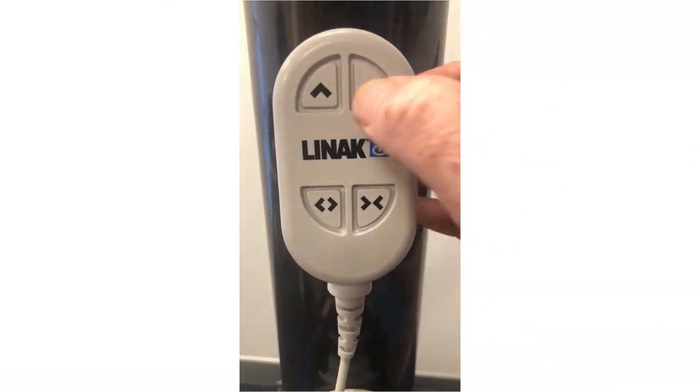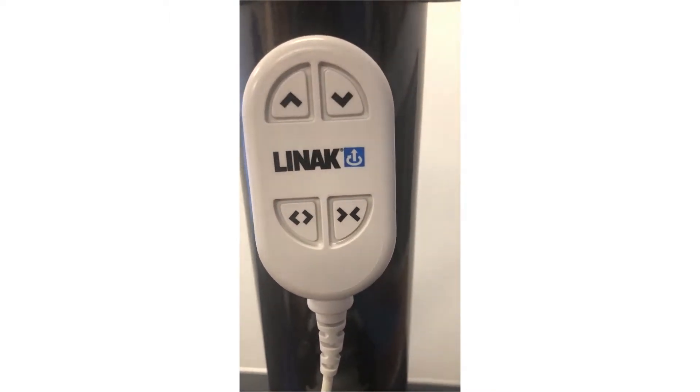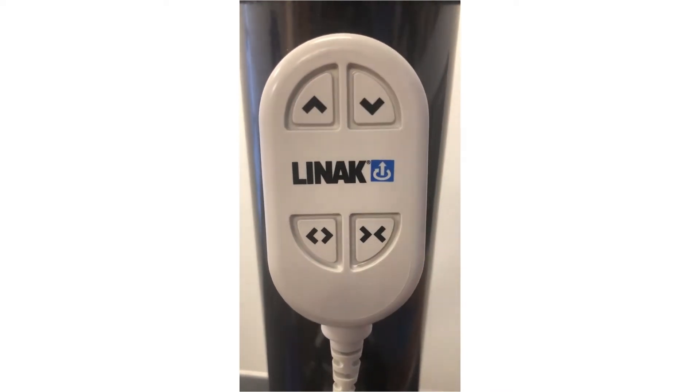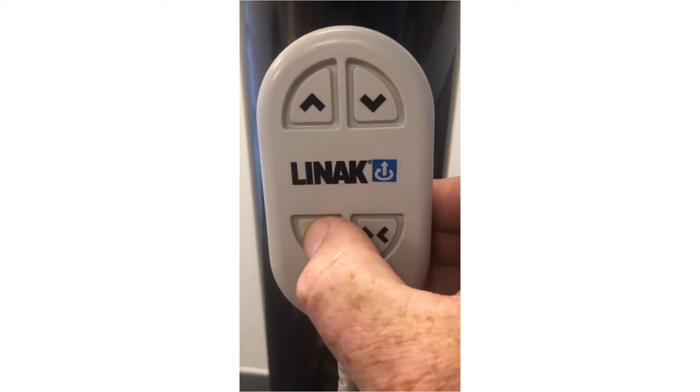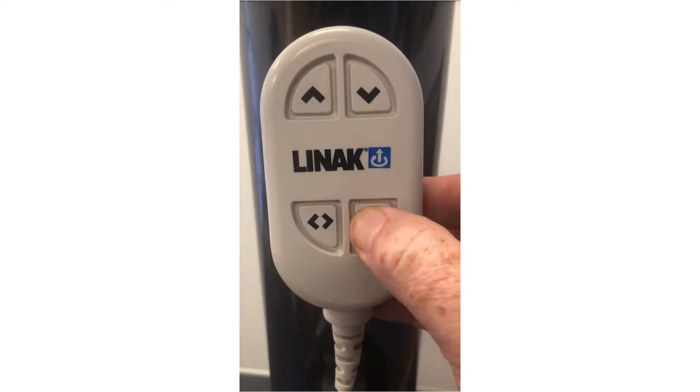The operation of the handset is to press the up arrow to shift the arm upwards and the down arrow to shift the arm downwards. Then for power rotation, press the left arrow to shift the arm left and the right arrow to shift the arm right.